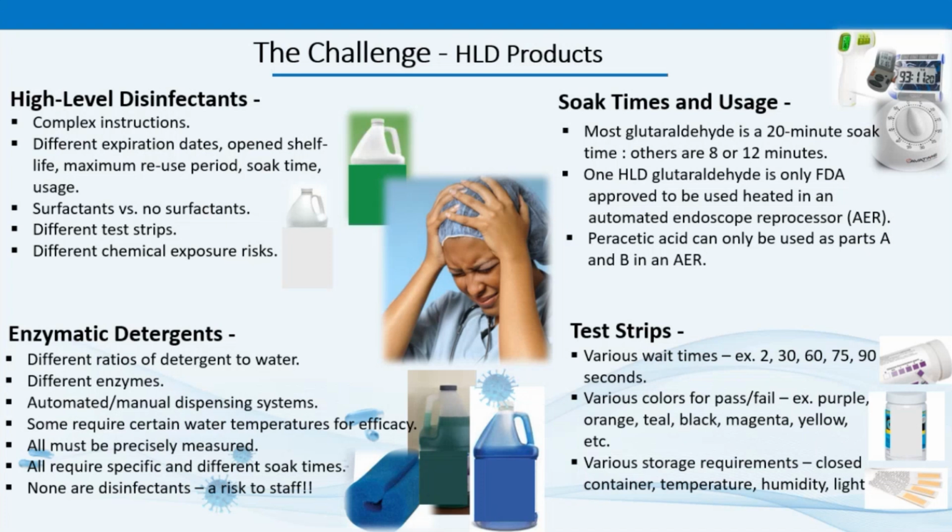How about those test strips? Current guidelines and IFUs recommend testing the MEC during each reprocessing cycle to ensure that the HLD concentration exceeds it. Each HLD requires a different test strip that has its own IFU and pass-fail conditions, manufacturer-defined shelf life, open container expiration date, and storage requirements. Keep the lid closed, maybe maintain a certain temperature, humidity, or light level. Many test strips also require QC checks on each newly opened bottle, which involves testing full strength and diluted disinfectant to ensure that the test strips provide correct readings.